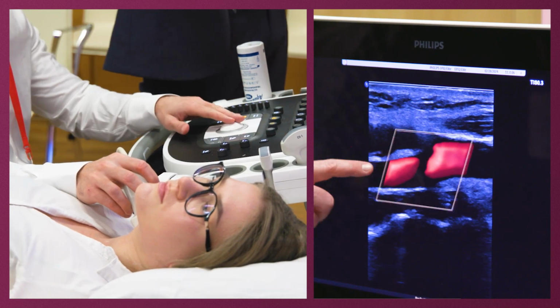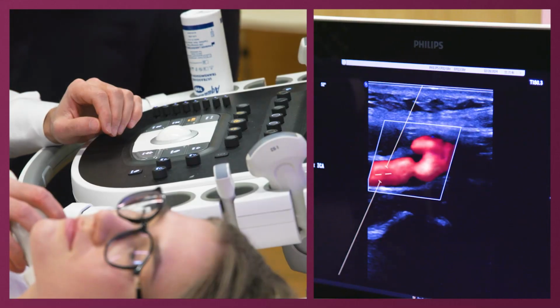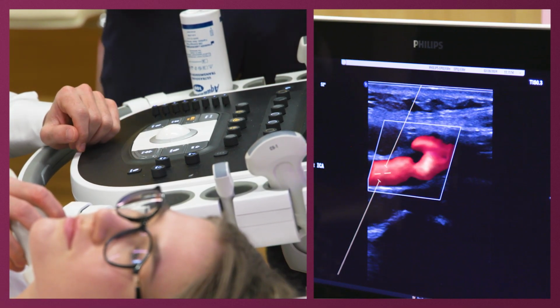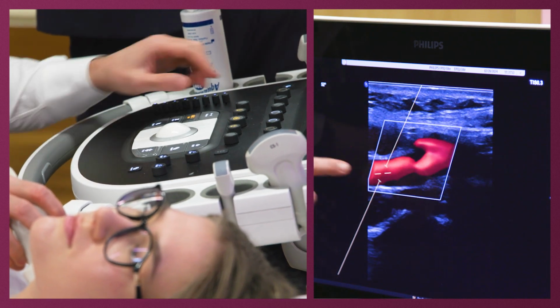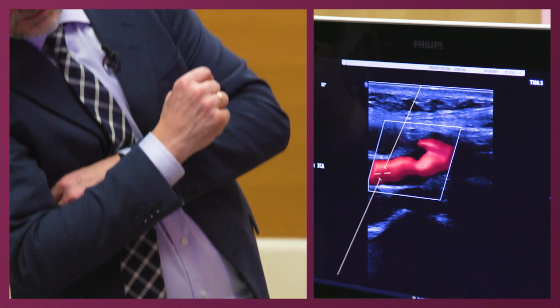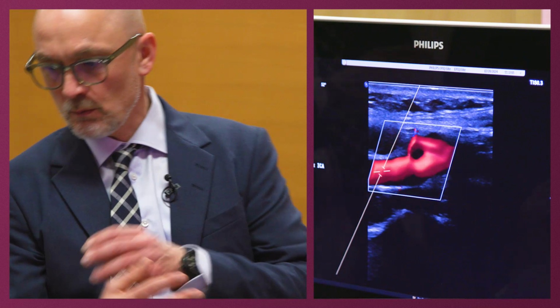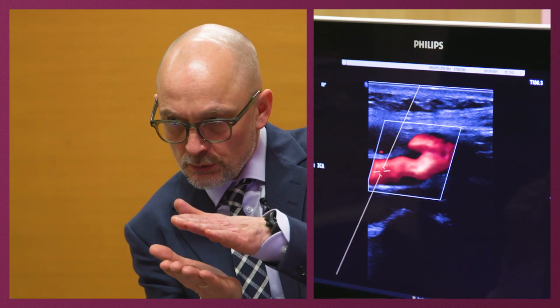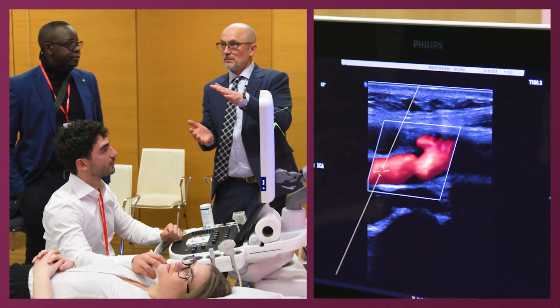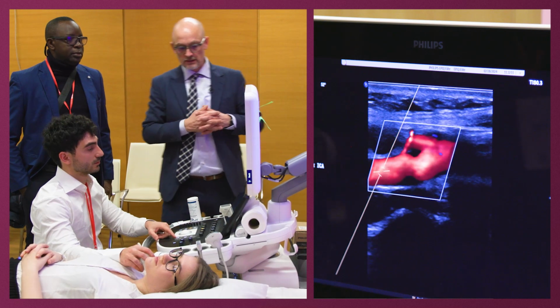Very nice. Was that a side branch? No. My rule of thumb is that it should be one third of the diameter of the vessel, approximately. So I think this is too big. I think maybe even smaller. It is most accurate when it's one third, the middle third. Because if you make it too wide, it may camouflage the peak systolic velocities that you're going to measure.